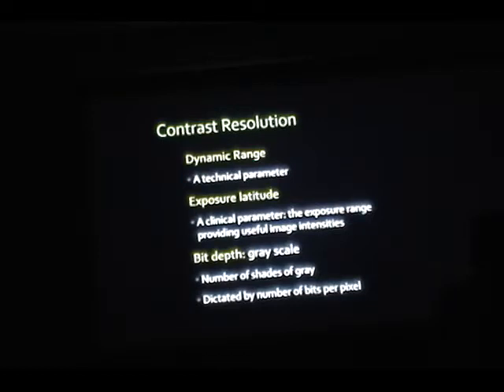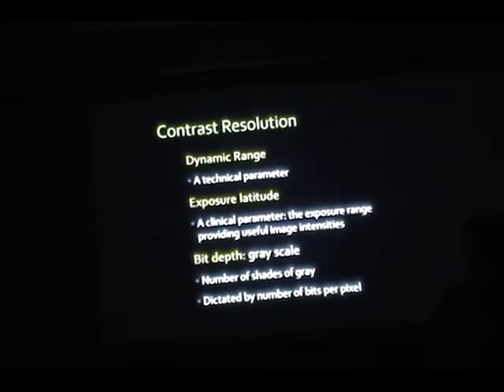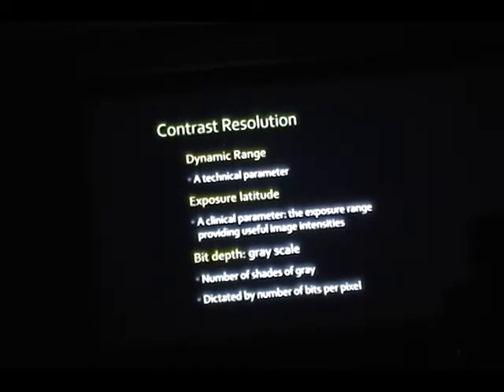So why do you think that is critical in our dentistry? We can see more details. Like the line between enamel and dentin. Okay, very good. Or the background in enamel. Yes. So we need to have a good contrast resolution. So remember, caries or dental caries is a contrast-based task. So that means you need to have a very, very good contrast resolution when you're looking for digital sensors.